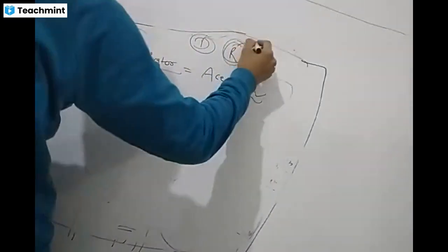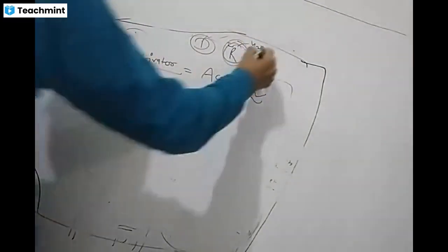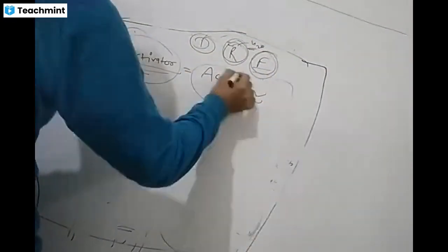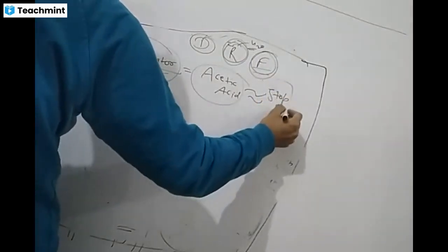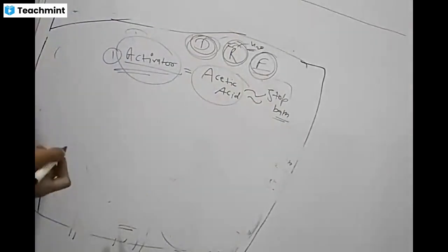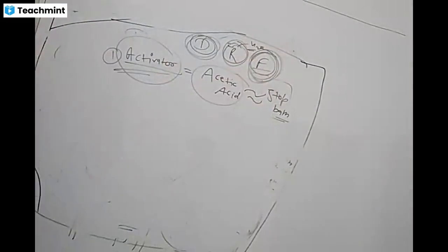If you use water only in the rinse step, then it is okay, because in the next step the fixing solution itself has its activator, acetic acid, that will act as a stop bath. It will neutralize the previous chemical from the developer solution and stop their action.